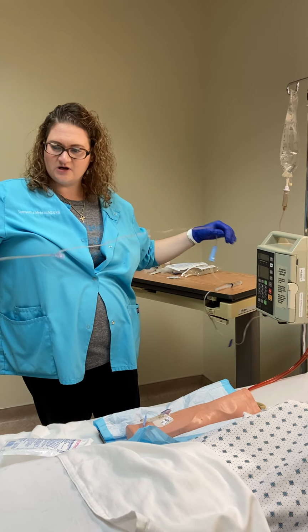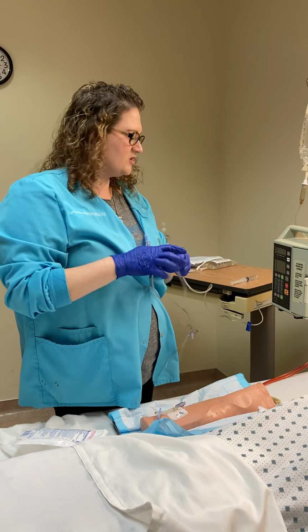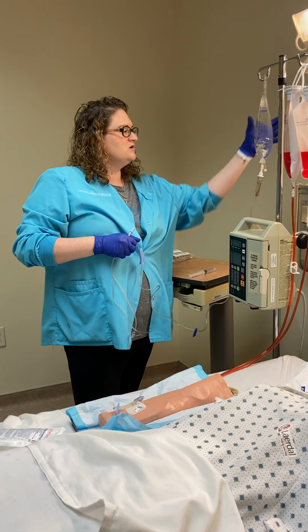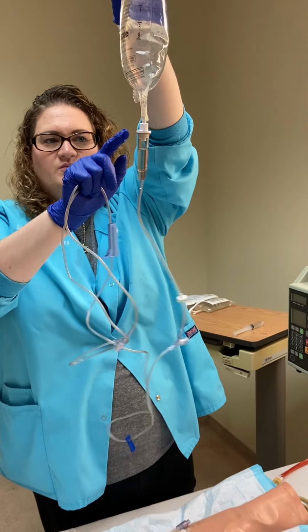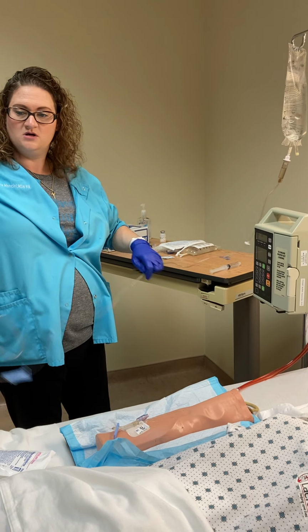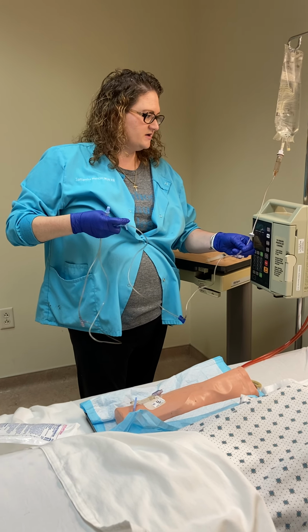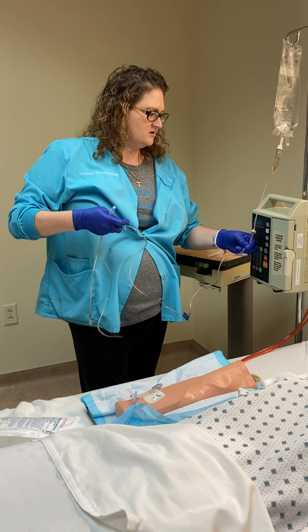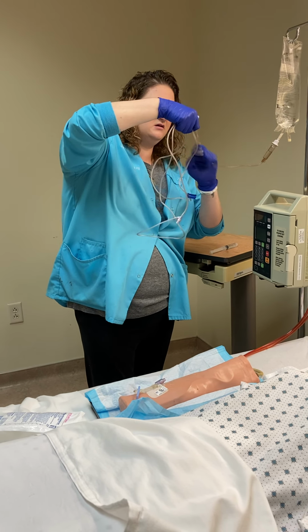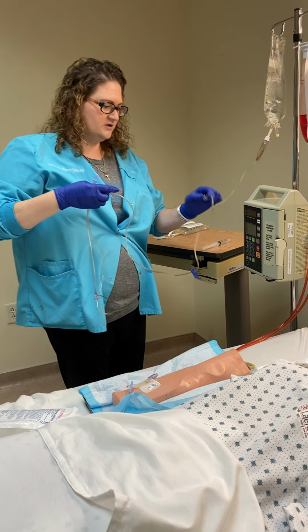The next thing we're going to do is we're going to prime it, and we need it to go all the way to the end and no air bubbles. So we're going to squeeze this chamber. We want it no more than half full because we need to be able to see the drops when we put our pump up. So I've got this all locked. I've primed my chamber, and I'm going to slowly unroll. And I want to make sure that I don't have any bubbles as this goes through. Sometimes you have to tap a little, get the bubbles out.